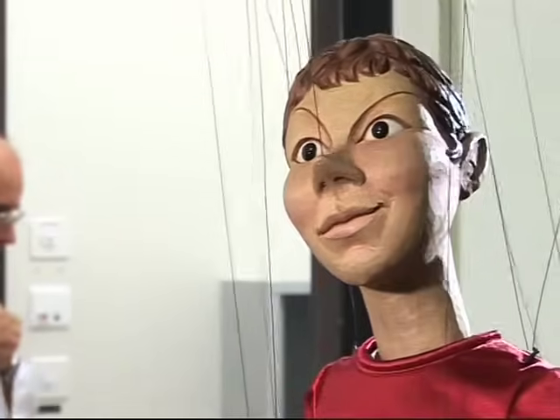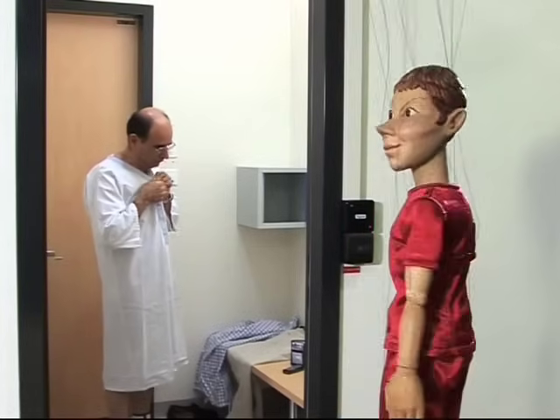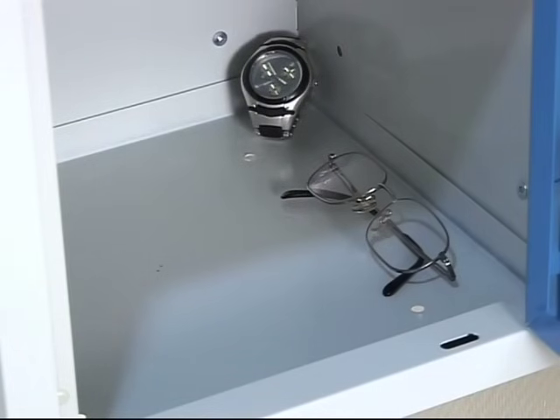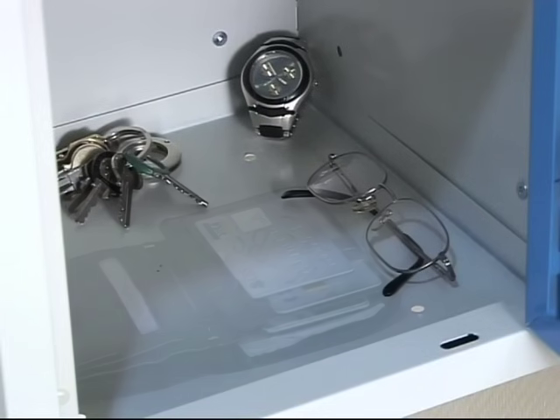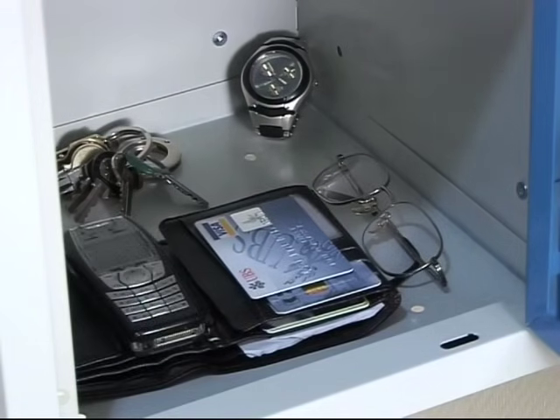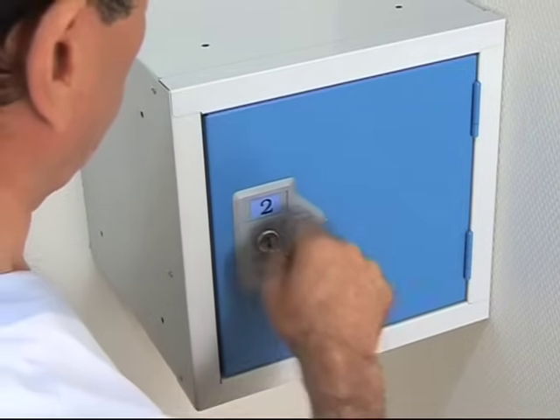Now it's time to undress and put on your hospital gown. Leave your glasses, metallic objects, and anything that could be affected by the magnetic field, like watches, credit cards, or cell phones, or there may be problems. You must also remove any dental apparatus.